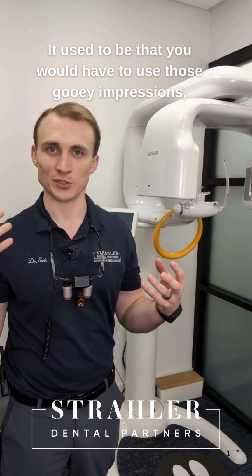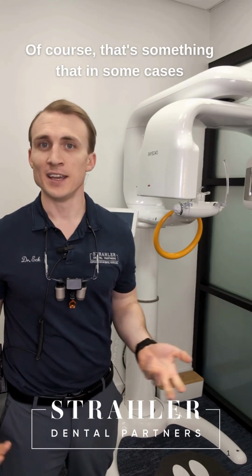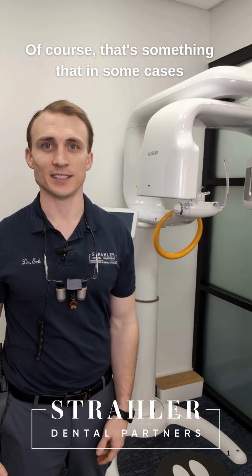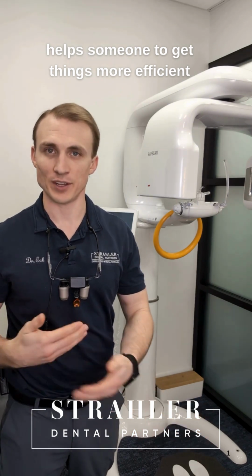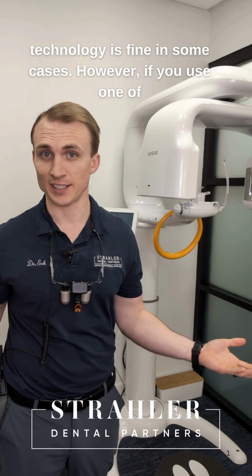one of my favorites is that 3D scanner. It used to be that you would have to use those gooey impressions, fill a whole tray with goo and then put it in someone's mouth. Of course, that's something that in some cases helps someone to get things more efficient in another way. So using old technology is fine in some cases.